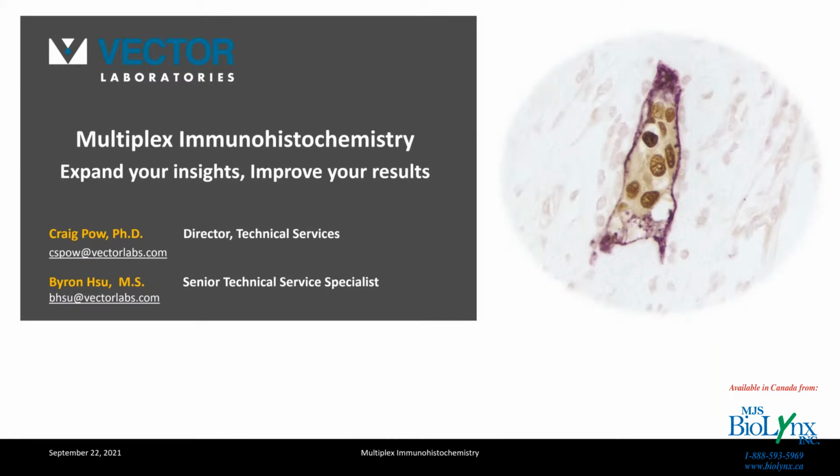As Byron mentioned, today's topic is multiplex immunohistochemistry. Just before I launch into the webinar, I'd like to clarify the term multiplex. I see this word as being adopted by the life sciences to explain methodologies used to visualize and detect two or more targets in a given specimen. Multiplexing may involve fluorescence or enzyme-based chromogens and look at genome profiling, protein expression, or a combination of these on the same specimen.